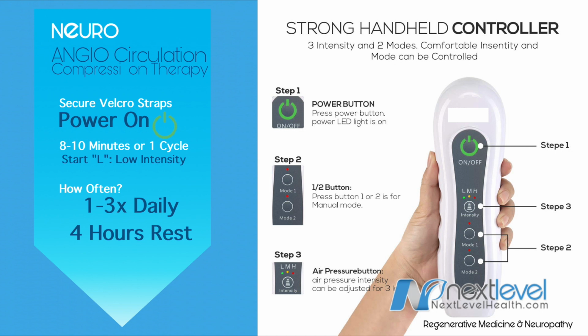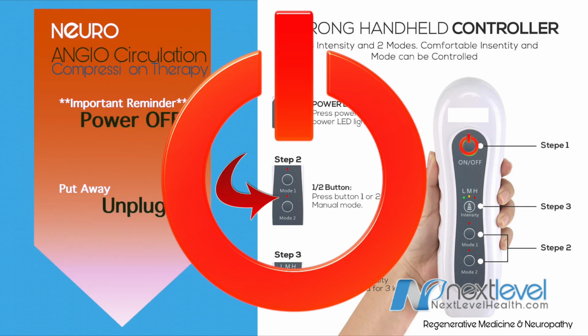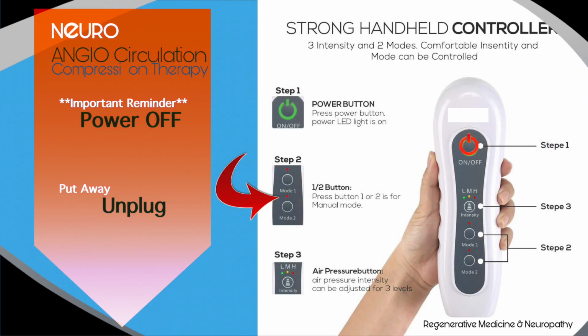Just be mindful of your personal hygiene. So we don't want this thing stinking. Keep your legs clean, attend to personal hygiene, and then put it away. Make sure you power your equipment off, unplug it, and put it away.